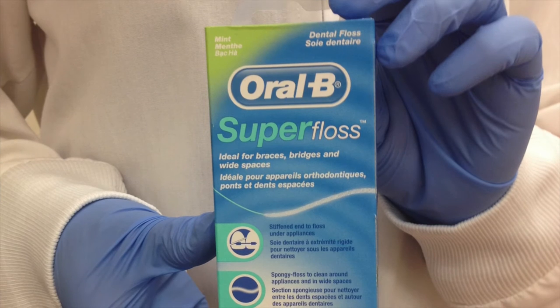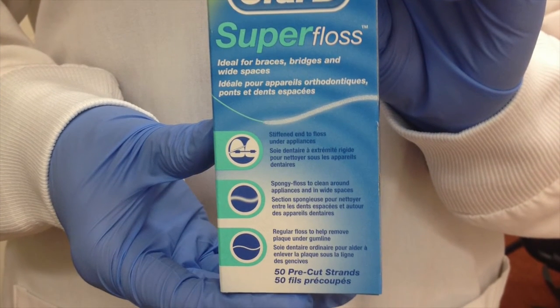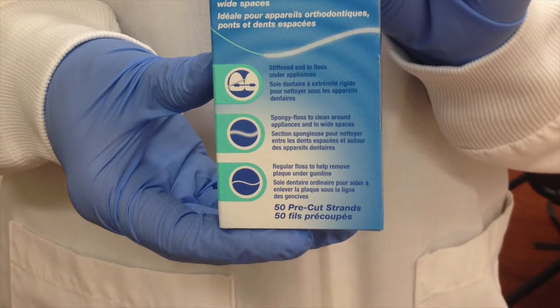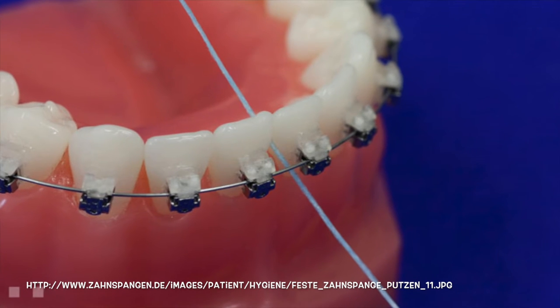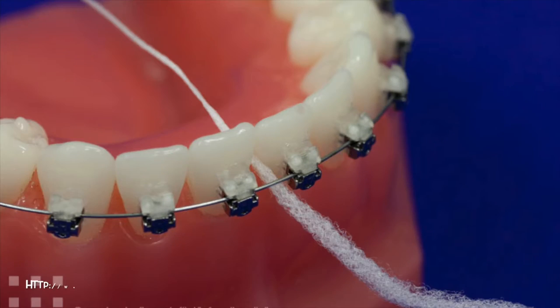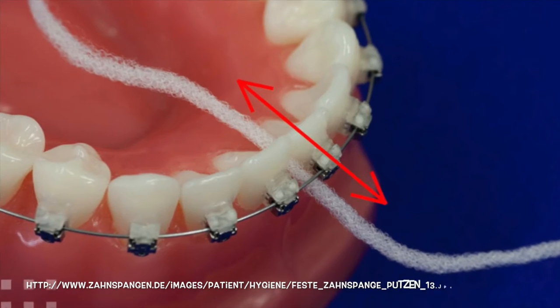Super floss. Has both a waxed and spongy portion. There is a stiff end which acts as a floss threader and inserts in between the teeth instead of being pulled down from above the contact. This is ideal for fixed appliances such as braces, bridges, and lingual wires.